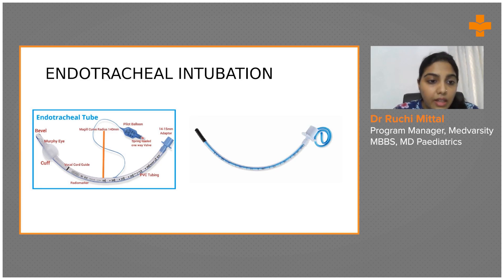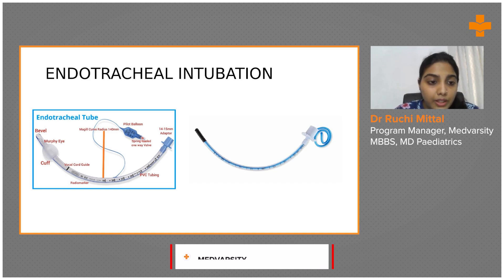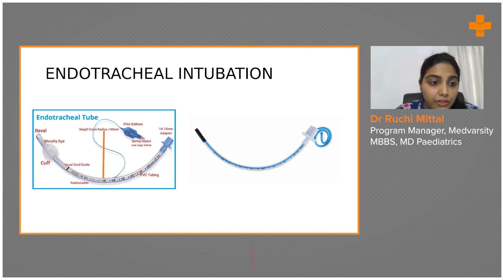Coming to the parts of the ET tube — look at the cuffed ET tube. You can see the inflated cuff, and to inflate it you use this pilot balloon which is blue in color. You insert your syringe here and fill in the air through this.